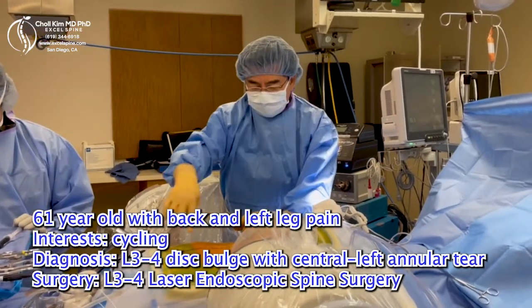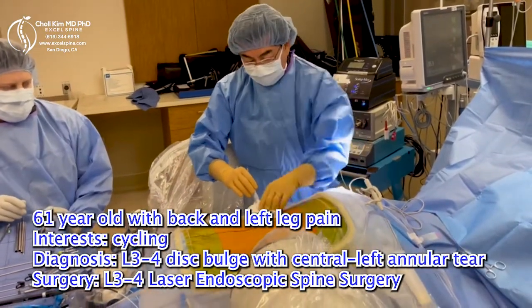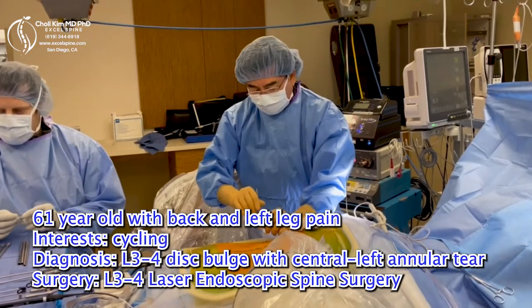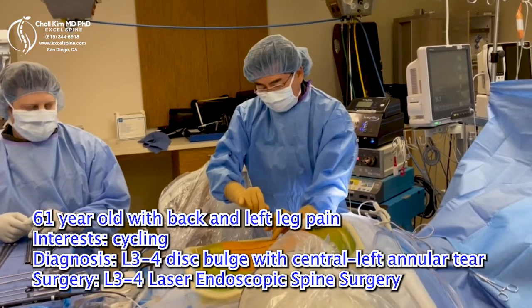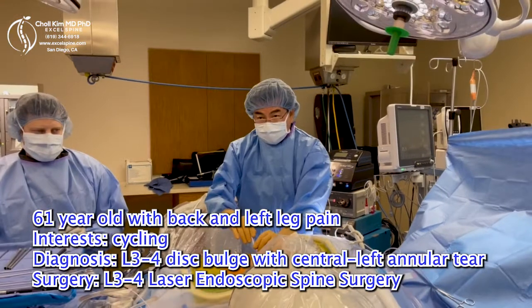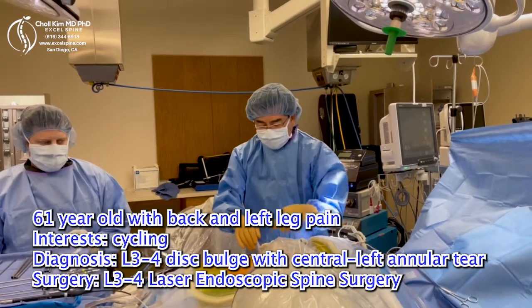Okay, we're getting started. I drew all these lines — if you're wondering how I draw them so straight freehand, I don't know, it just happens when I'm in the zone. Now I made the perfect entry point, little poke hole. I'm using the spaghetti noodle dilator with delicate fingers, pinkies out, to slowly and carefully make my way to the promised land. Dr. Asimov is in the background — he's the neuromonitoring physician, and if I get too close to the nerves, he'll say something.